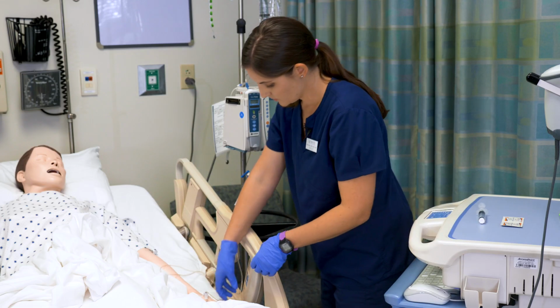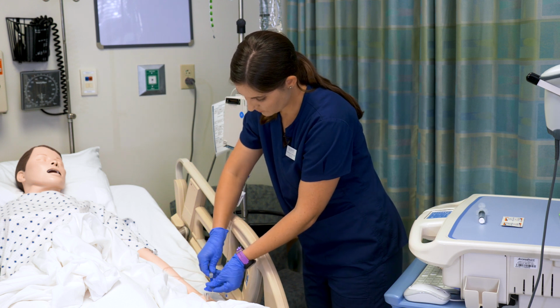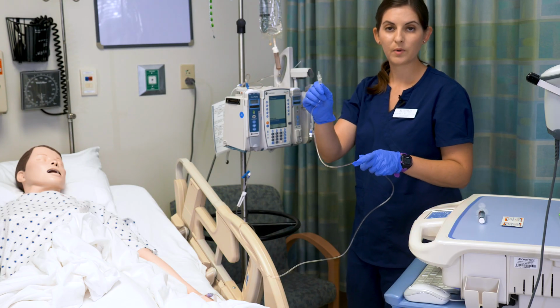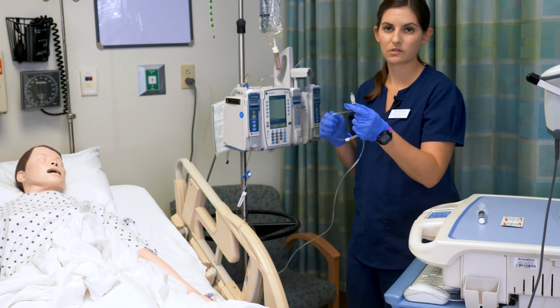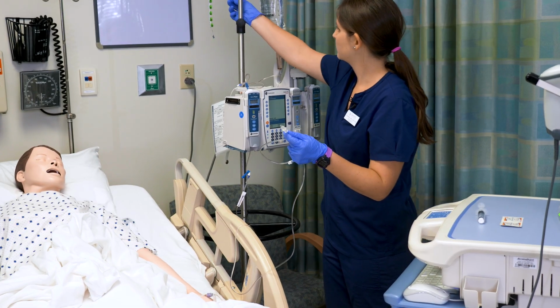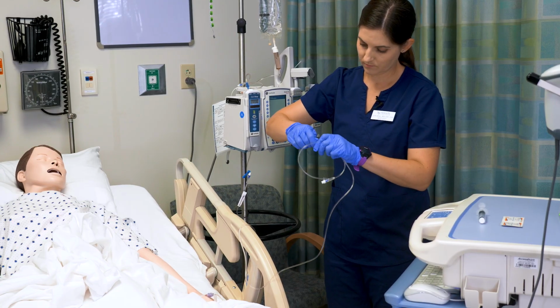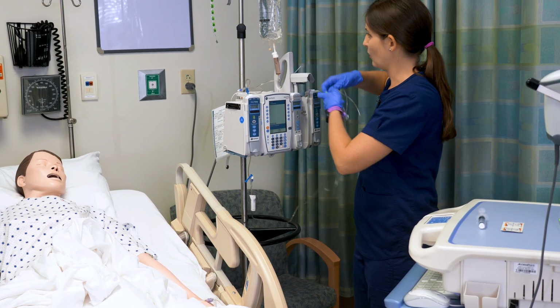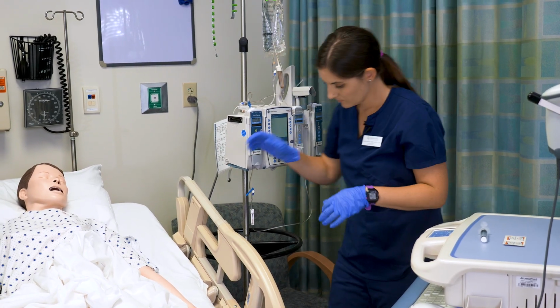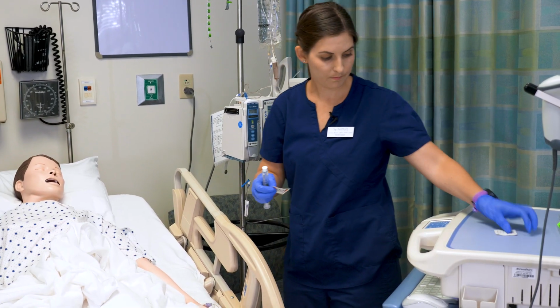Okay, so now what I need is a Curo tip for the end of my IV line. If I had to leave my IV line just open, I would not be able to use it again. It is considered non-sterile. So to keep it sterile, I'm going to use one of the Curo tips. And then hang it back on my pole over here. Okay. I then need to flush my line one more time.